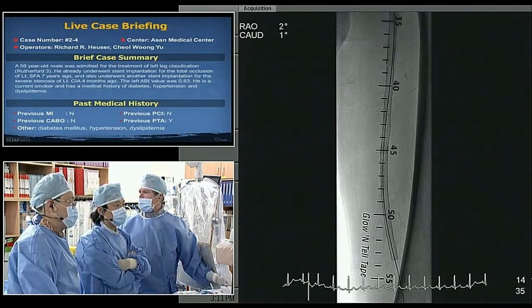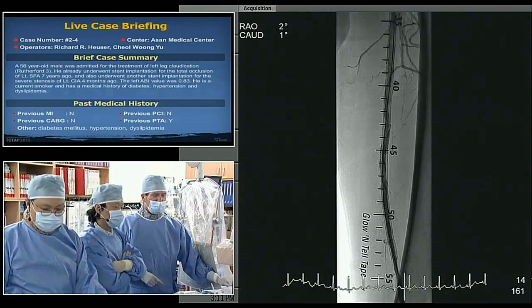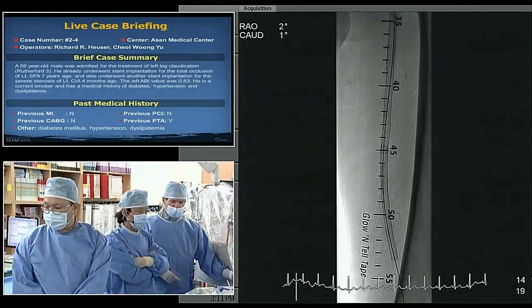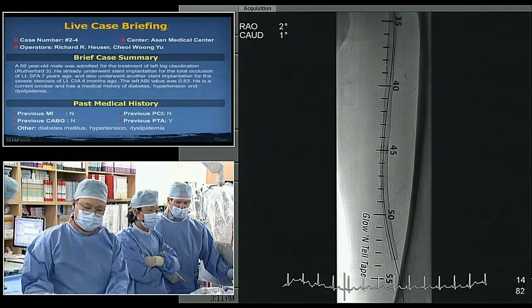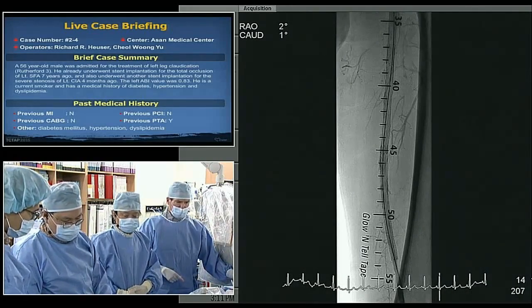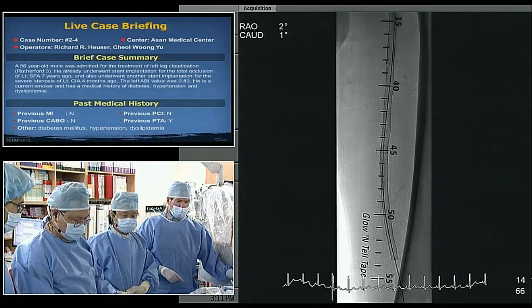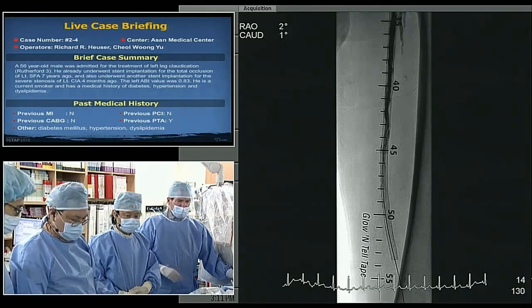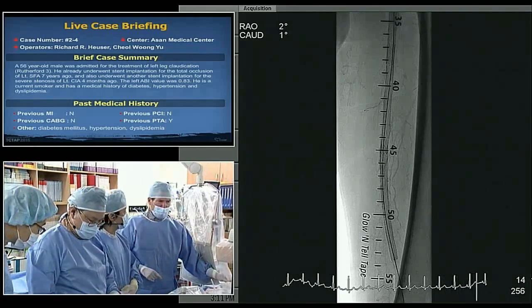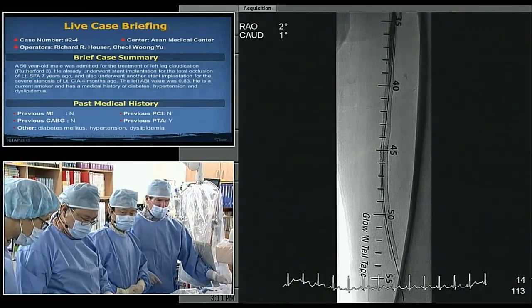Let's get the drug-eluting balloon. Yeah, I think that you can always go down the road of a covered stent graft. I think you could probably get away with allowing it to fail one more time before you go down that road, and just use the drug-coated balloon technology. You're preaching to the choir. Yeah, I'm very conservative on the covered stent. I feel that once I put the covered stent, the only other option after that is fem-pop. And this gentleman, I don't think we need to go that route. I think the drug-eluting balloon to start with sounds good.